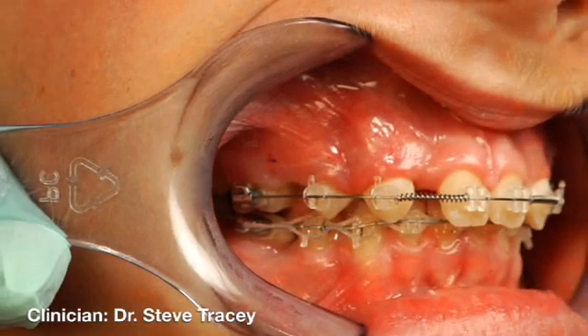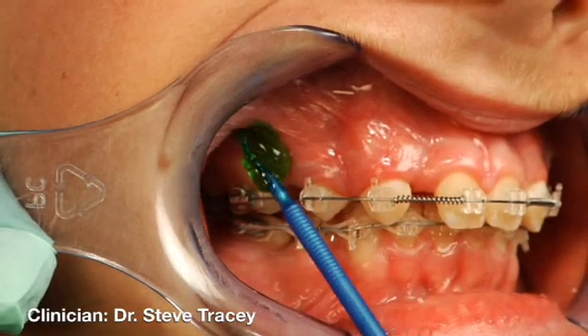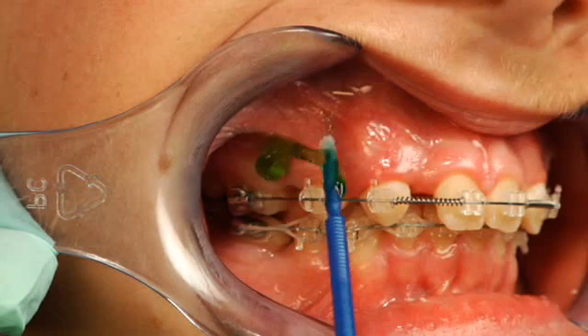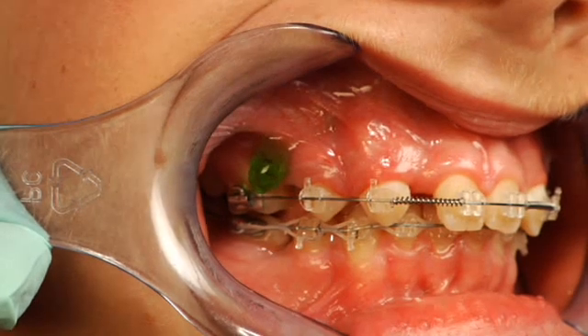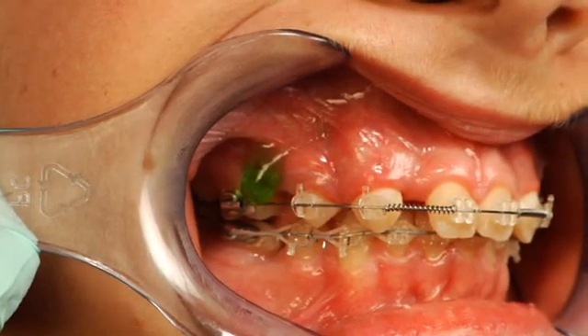Our first step is to place some topical anesthetic. This is a very profound topical anesthetic that we obtain from a compounding pharmacy. It's composed of 10% lidocaine, 10% prilocaine, 4% tetracaine, and 2% phenylephrine.